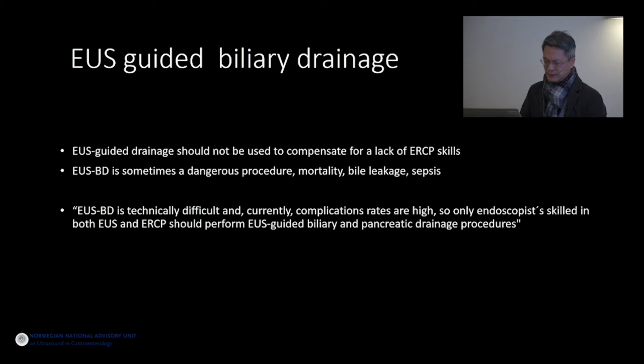So it is a citation from an article I found. It should be in skilled hands, which is someone who is able to perform both EUS and ERCP.